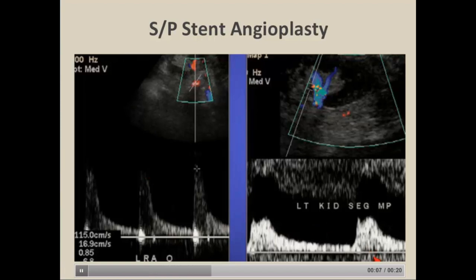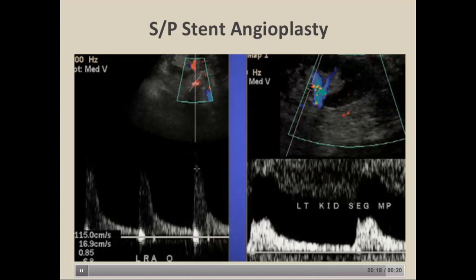The normal peak systolic velocity range in the renal artery is between 60 and 100 centimeters per second — the same as the abdominal aorta. You need to know your normal velocity range for context.